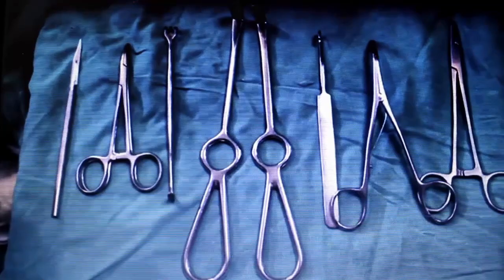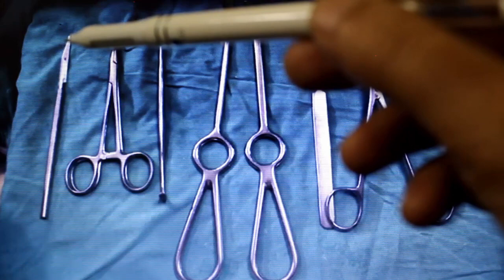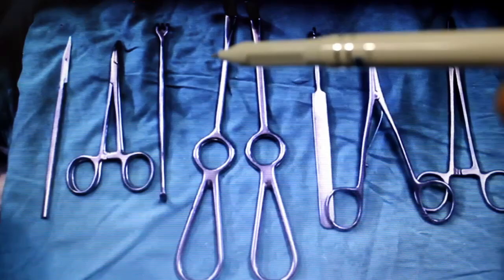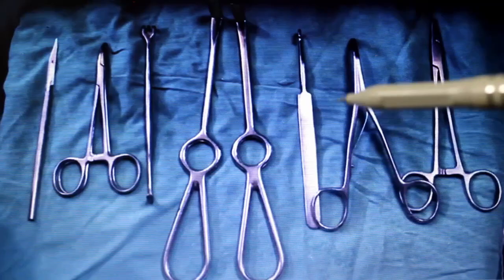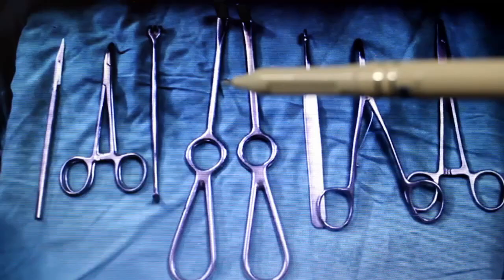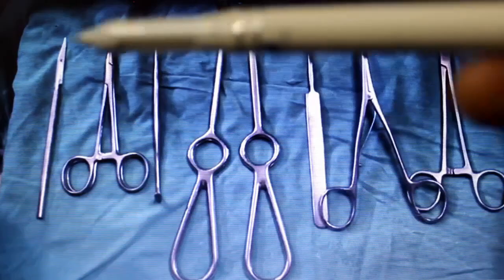These are the instruments needed for doing a tracheostomy. A number 15 and a number 11 blade with a BP handle, straight and curved artery forceps, a hook with a right angle retractor, two Langenbeck retractors, cricoid hook, tracheal dilator and needle holder. Of this, the tracheal dilator, cricoid hook, the Langenbeck retractors and the blade with BP handle are very essential for performing a tracheostomy.